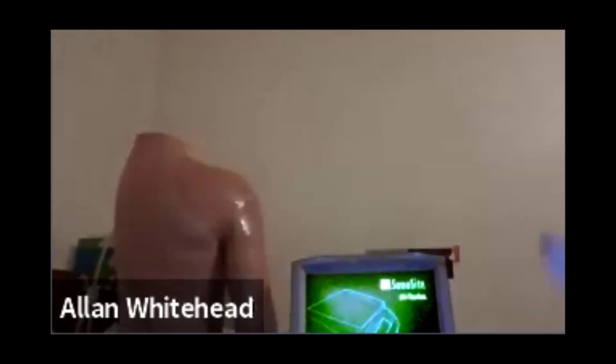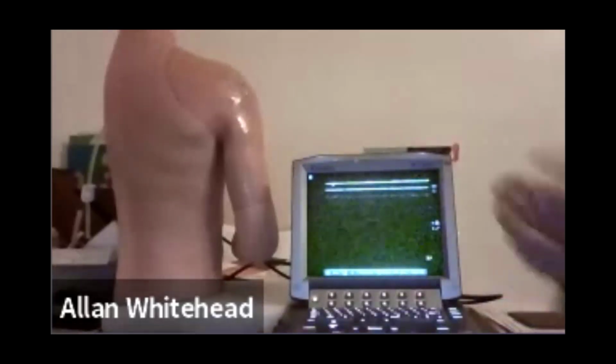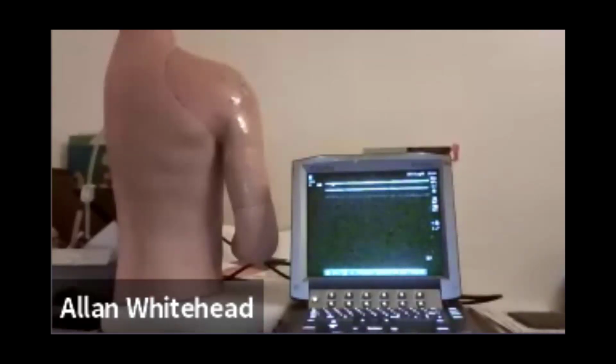And so now we're going to demonstrate. So we did practice before you came on air, trying to make sure this all lines up. I only turned the machine off just to save battery because for some reason it was being a bit frustrating and not charging on the power, and I didn't want it to go off while I was doing it. Alan, just tip your computer down a little bit. A little more. That's it. Good. Yep. I haven't changed the laptop angle, so hopefully that'll be okay.